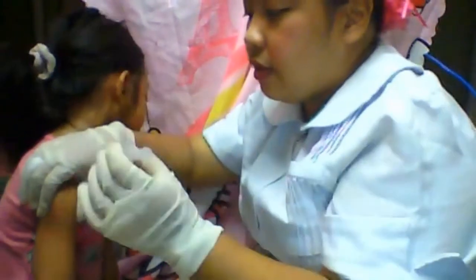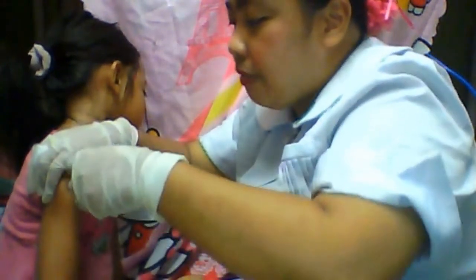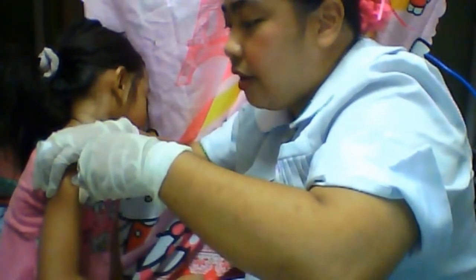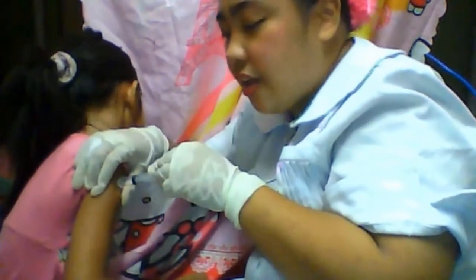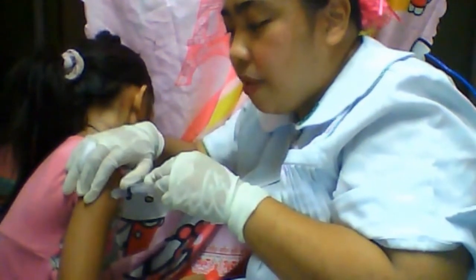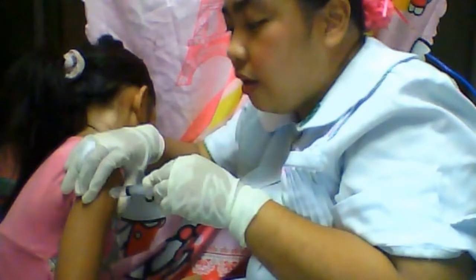Okay, you do it like that, and then you want to aspirate just a little bit. Okay, you want to make sure that you are not hitting a blood vessel. Okay, if you see blood coming through the syringe, it means you are aspirating or you are hitting a blood vessel.